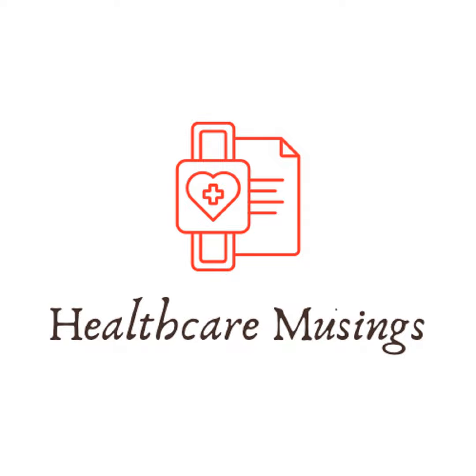You either want spontaneous breathing with pressure support, or you want assisted volume control. Pick one, and they're equivalent. I can do the same with both. The only difference is on the pressure support. Now, every ventilator has apnea ventilation, so you don't die on the ventilator. But if you turn it off, even though you should never do that, just theoretically, on pressure support, it's completely spontaneous. The ventilator will not give you rescue breaths. There's no backup rate. It's totally spontaneous. Whereas, at least on assisted volume control, the respiratory rate you dial in is the backup rate. If you just totally stop breathing, you'll get whatever respiratory rate I dial in.